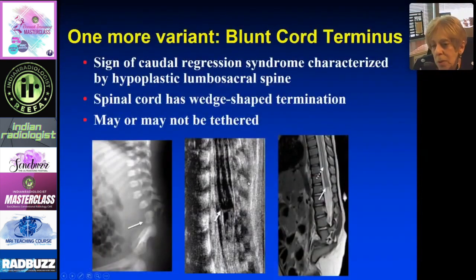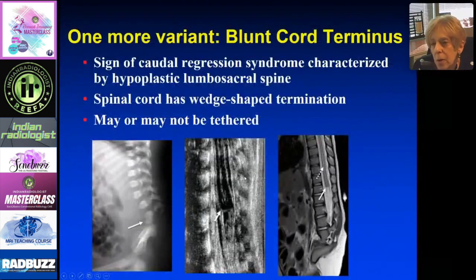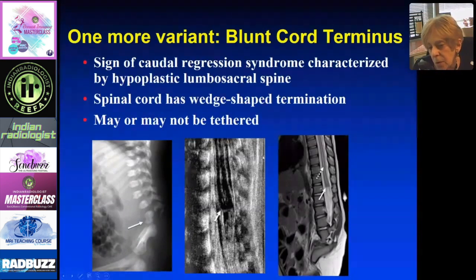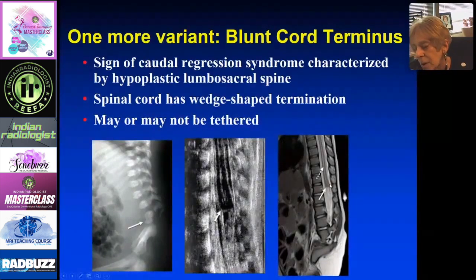One more variant: normally the cord has a tapered end, but in patients with caudal regression — meaning a hypoplastic or partially missing lumbosacral spine — the spinal cord can have a wedge-shaped or blunt end. In a patient missing most of the sacrum, instead of a tapered appearance, the cord has this blunt termination, which is confirmed on the corresponding MRI. This is just a variant seen with spinal anomalies.